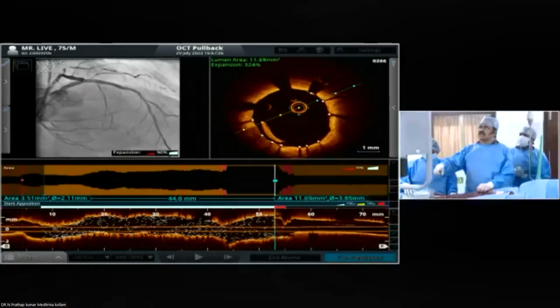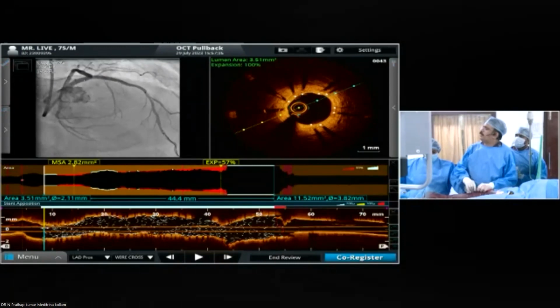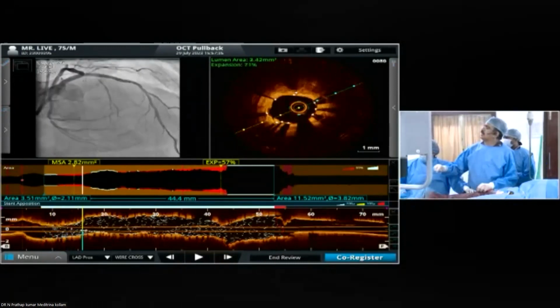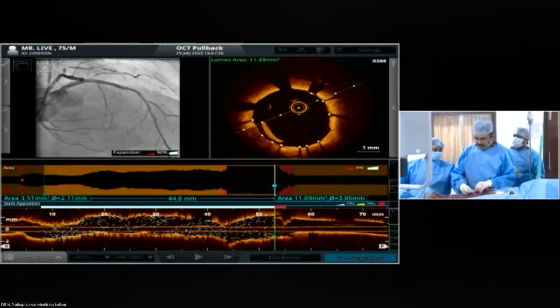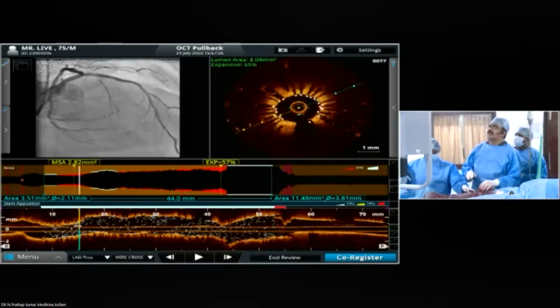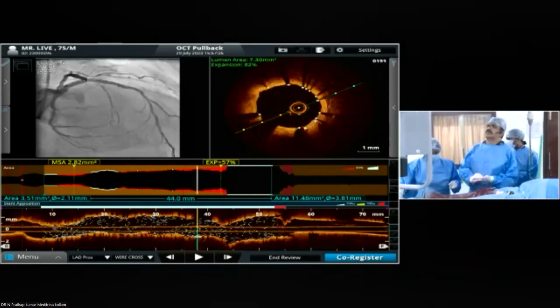Can you see the OCT distal part, the most important part? We took a 3.5 millimeter balloon. Can you just show that properly? There is no edge dissection. Saurabh, this is the point I was telling yesterday. There is no edge dissection created by that, and some more dilatation is required in the distal part, which I was reluctant to do because the measurement was only 3 millimeters. So I just went with 8 atmosphere, which created 3.31 by post dilatation.